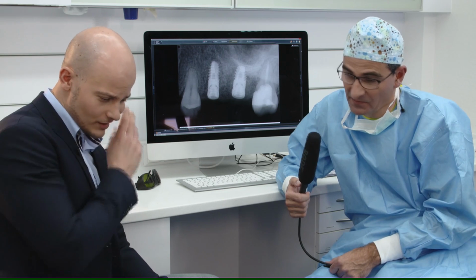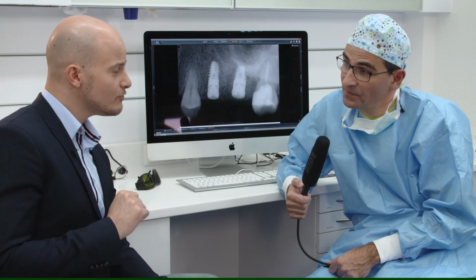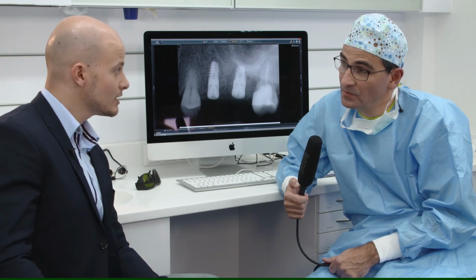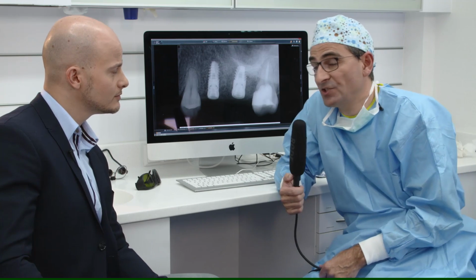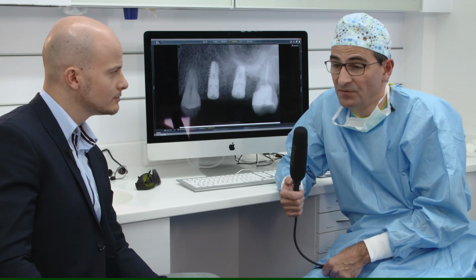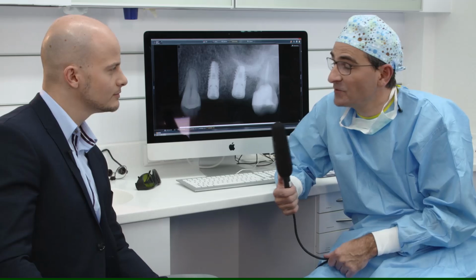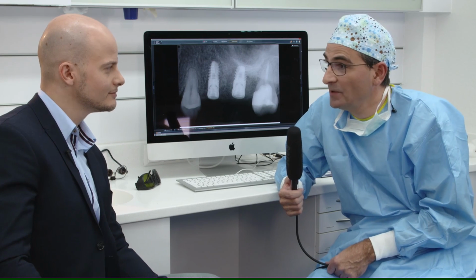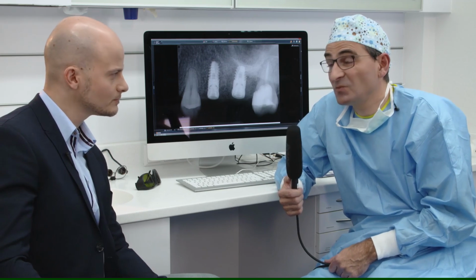I think it's one of the last questions. If you are using mini implants, what do you think about that? As we started in implantology in 1992, it was 15 millimeters, with 4.5, 5.5, and 6.5 diameters. If you had placed an implant at that time that was only 8 millimeters and 3.4, it would have failed. But now we see the studies and everything, and we know that this will work.